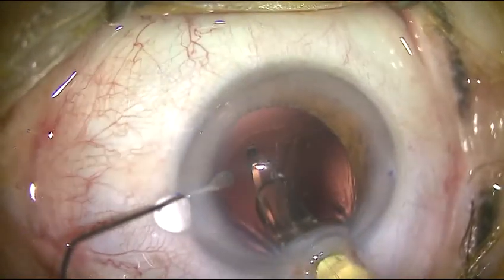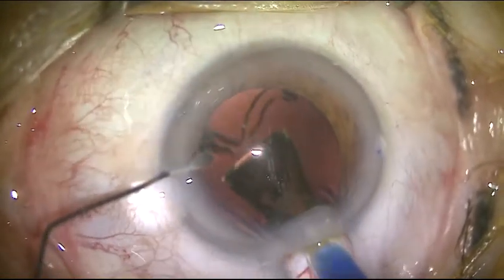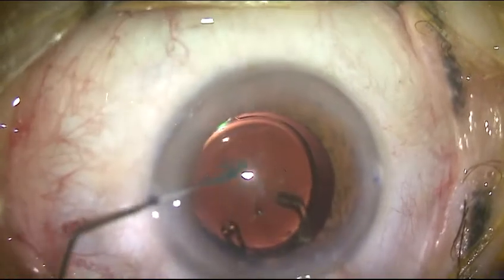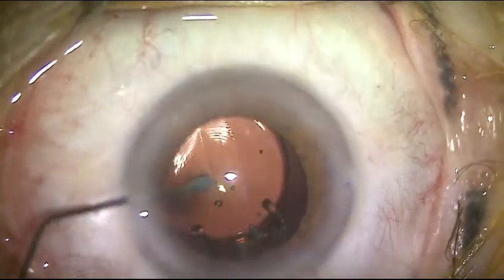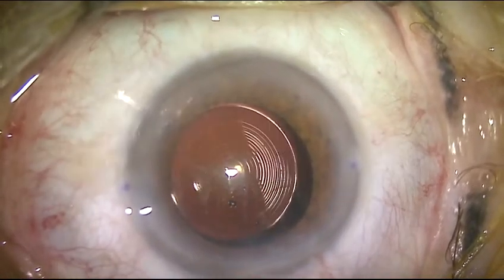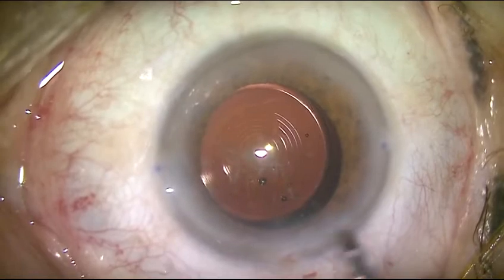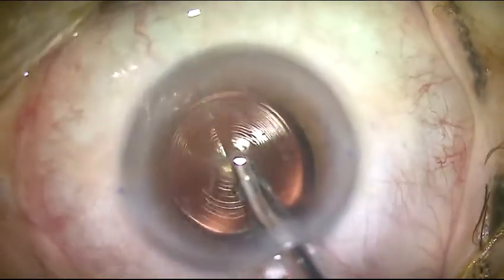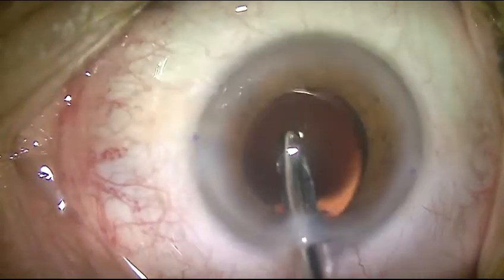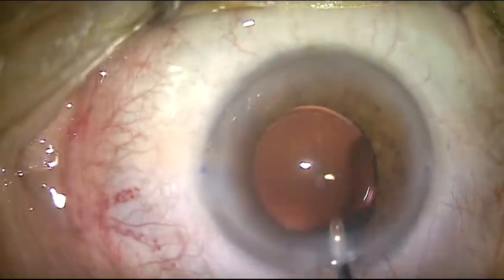Making sure that the leading haptics are inside the bag, and gently releasing the lens in the bag. With the second instrument, pushing the other haptics also into place. The lens is in the bag — let all haptics unfold. Followed by irrigation aspiration, and concluding by centering the lens in the eye.